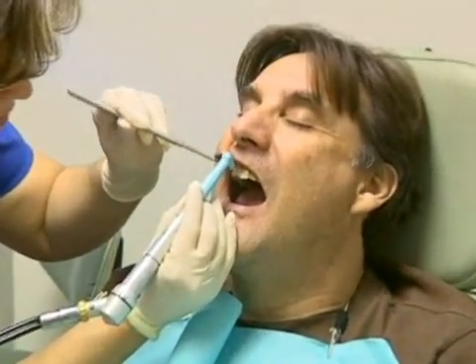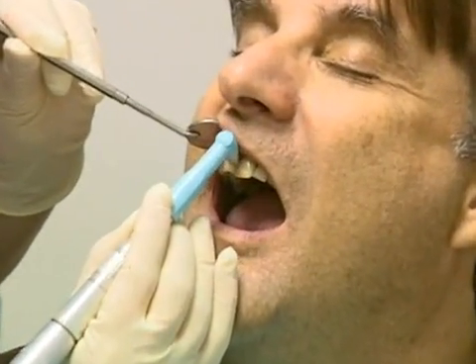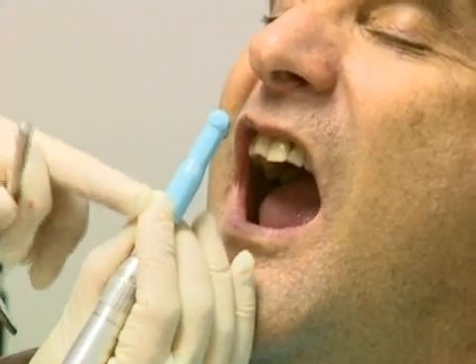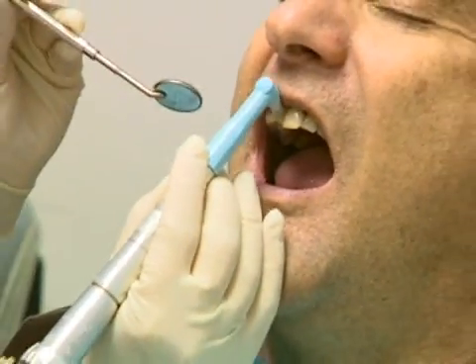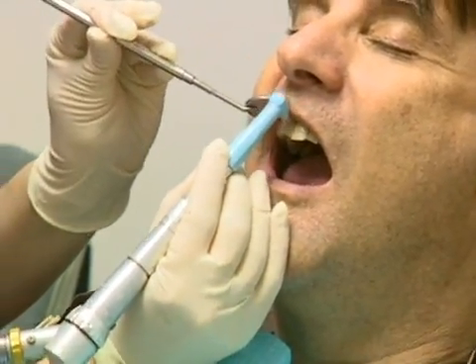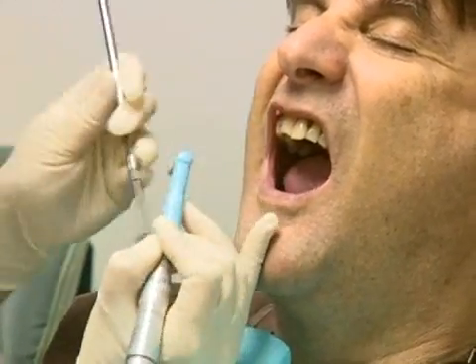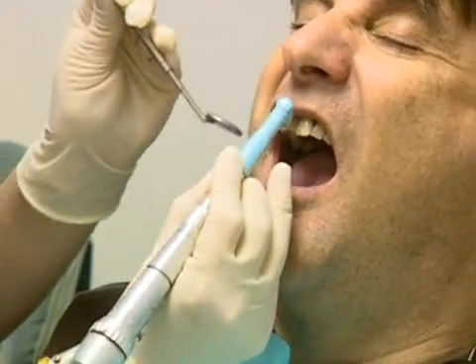So while you're doing this, you pull the gum up and swipe — three swipes total. Make sure you get three swipes and hold it in a pen-like grip so you can get all of this part of the tooth. Always keep your pinky right here so you can go right back there and then go right back up again, up and down.